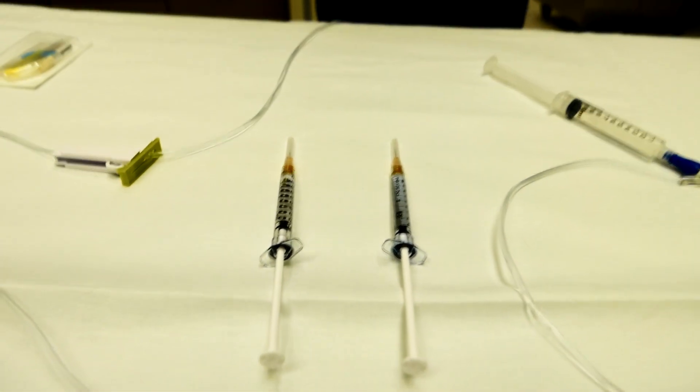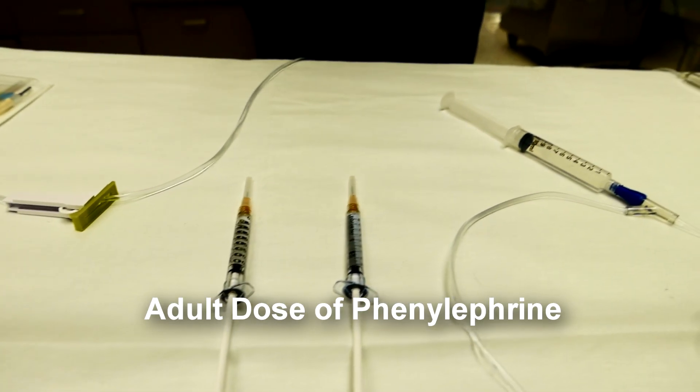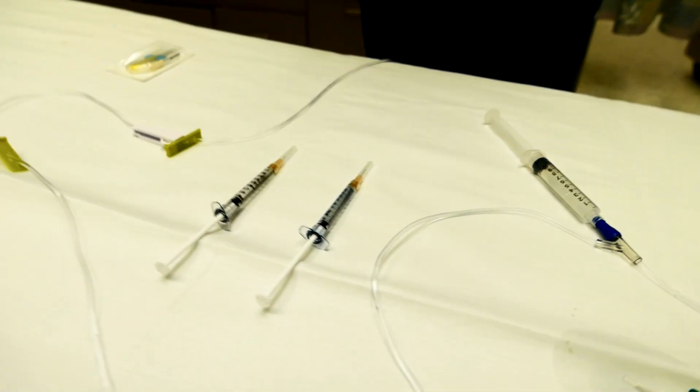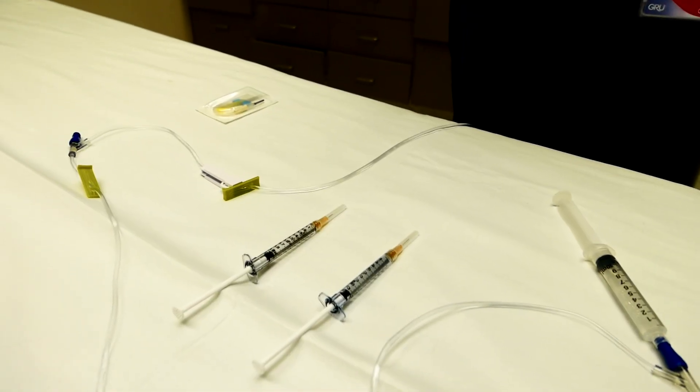Once I start to see some detumescence, I go into my phenylephrine — this is 500 micrograms per ml — and do a single injection. We just finished treating a patient with priapism and only really needed one of our three syringes that we had set up previously.